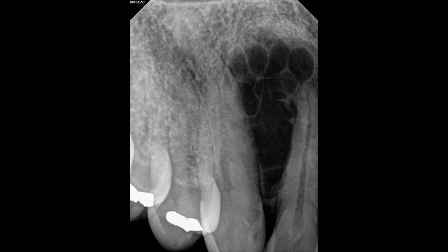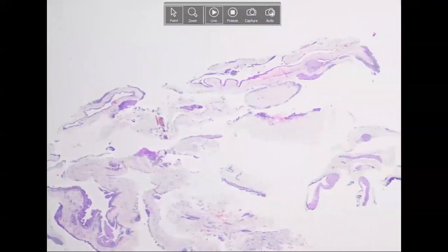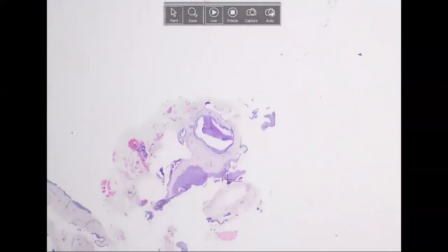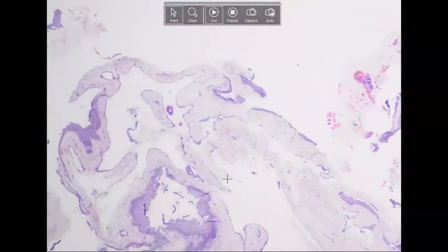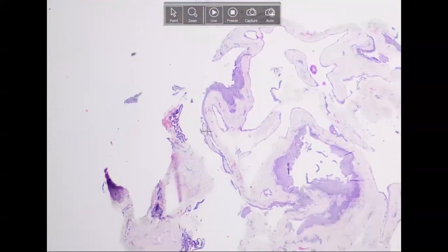The next case is a man in their mid to late 40s with expansion between teeth number six and seven. You can appreciate that this has a soap bubble appearance. Here is the histology at lower power — a multi-cystic area with multiple compartments of different cysts. Like the lateral periodontal cyst, there are areas of thin epithelium one cell layer thick, and then thicker plaque-like changes.